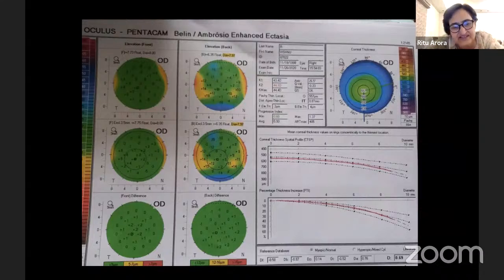Like today only, somebody sent me one pentacam of a 21-year-old lady who had gone for refractive surgery. I wish I could project that. It has absolutely regular astigmatism, 3 diopter regular, symmetrical, bow tie, 44 and 47. Thinnest pachy is 523. But one of the maps had something yellow, so the person was a little cautious whether I should do refractive surgery in this patient. But those things will not apply to an astigmatic cornea.